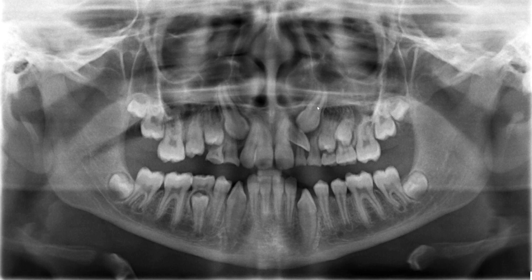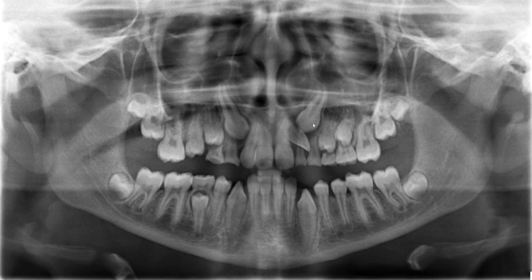When we have these impactions, you want to ask yourself: where are the precise locations of these impacted teeth? Additionally, are there any resorption of the permanent lateral incisor? It doesn't appear to be that way here, but assessing the resorption of the lateral incisor can definitely be difficult. How is this canine located relative to the lateral — is it really directly on top, or is this canine perhaps buccal or lingual to the lateral incisor? It appears they're right on top of one another.